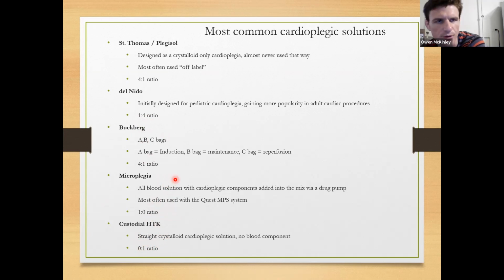I was going to say the reduced hemodilution, but I mean, you did just mention it. Is there another really positive advantage of it, or is that one of the main things? Like if you have some huge 8-hour case, you're not overly diluting your patient. I would say the main advantage is, yeah, you're decreasing the hemodilution because you're not giving a crystalloid component per se with your cardioplegia. So I would say that's the big advantage.